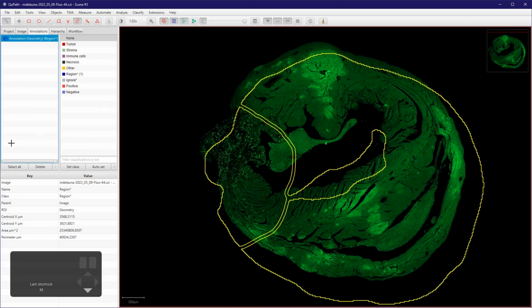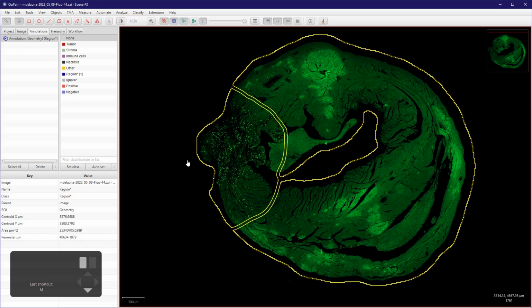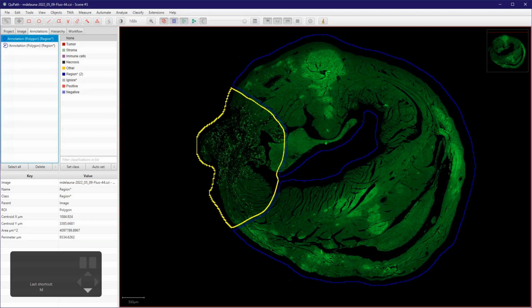And now this is still just one region, and I just moved it so I put it back in place. Sorry for that. And then you have to right click, edit single, and split. So now you have 2 objects, and so here you can measure that with another method if you want to, and here you can get some information like the area or something like this, which would be of interest for you, for instance.